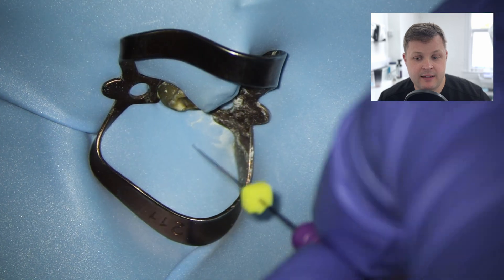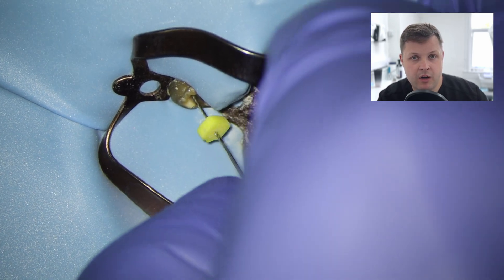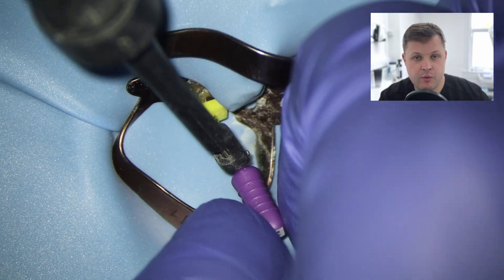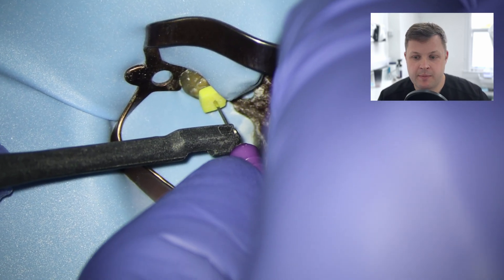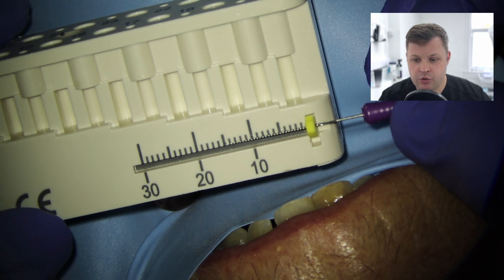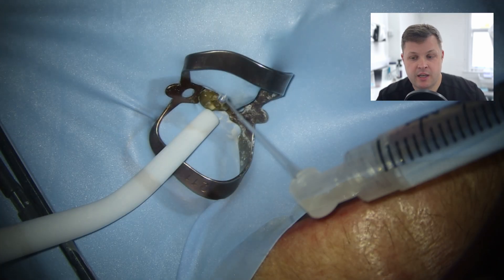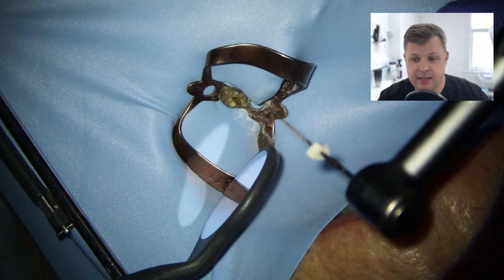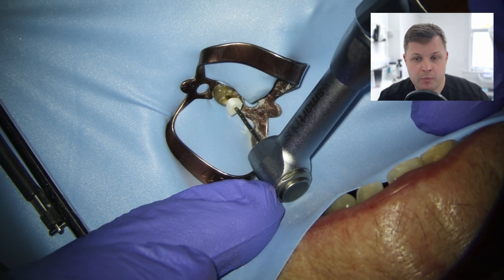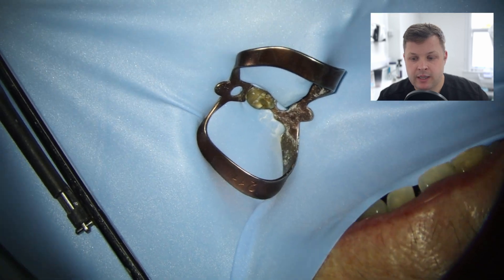I move to a size 10 with a small bend at the end, introduce it into the canal using the rubber stopper orientation from the previous file, check working length to zero, and shape with in-and-out movements. Working length is 15 millimetres — quite short, but that's because there's no crown present; with a crown, it would be around 21 millimetres. I then use the size 15 Hyflex glider file to the zero reading. There's a slight ledge at the portal of exit, so I use T-mode on the motor — a 90-degree back-and-forth watch-winding motion — to reach the end.